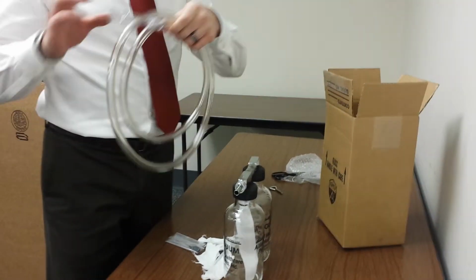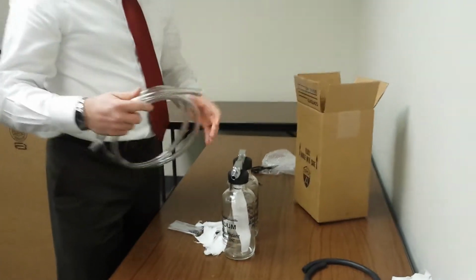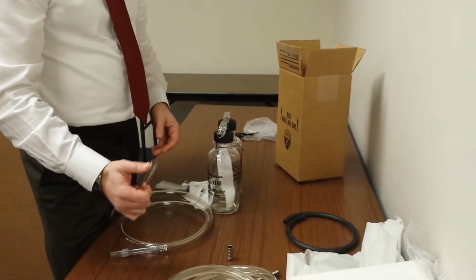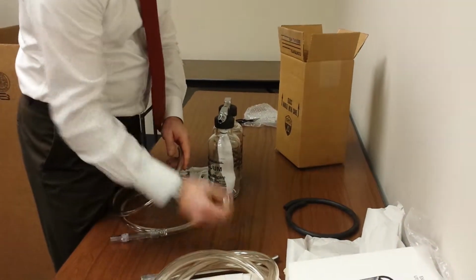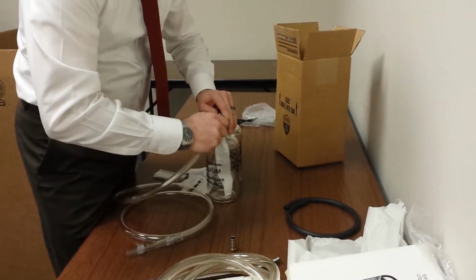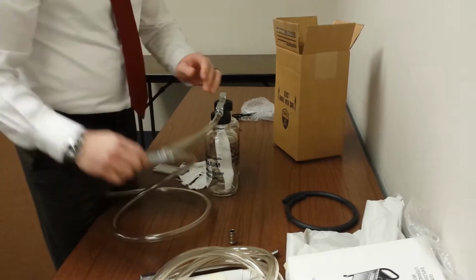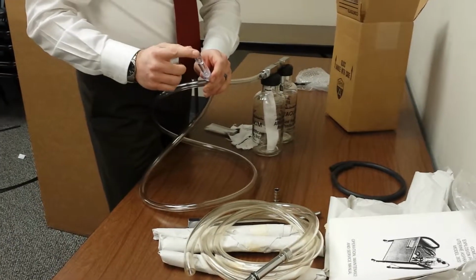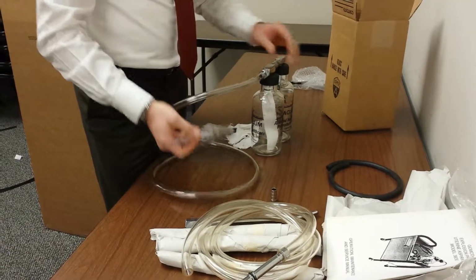This is an example. This is a Gyrus set, and I believe Berkeley makes one as well. But they're usually designed around 3/8-inch tubing, or you can sometimes get 1/2-inch tubing, in which case you'll use this adapter. With the 3/8-inch tubing, that simply attaches, and instead of the metal adapter piece, you'll use this plastic adapter piece, and your plastic curette systems will go into the end of that.